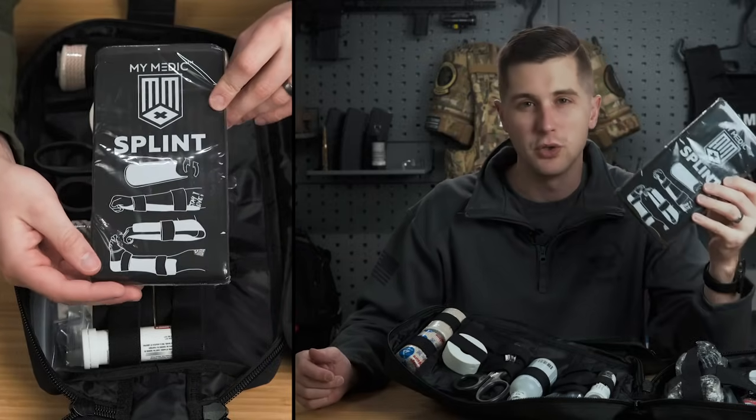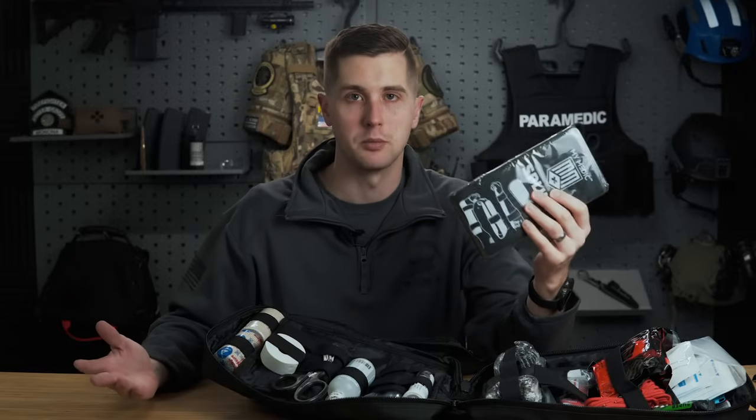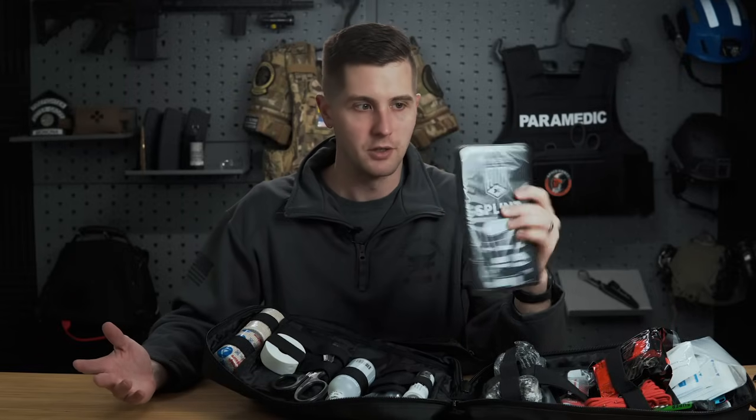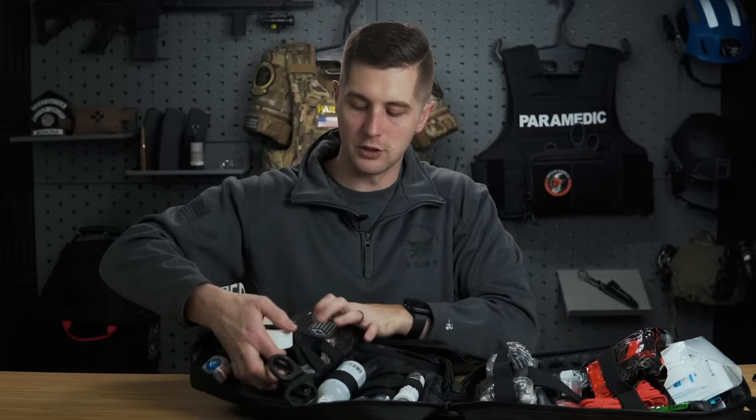This is kind of my go-to when it comes to pre-hospital splinting. On the ambulance, we've got vacuum splints, which are great, but they're not portable. This is the best portable splint on the market, if you ask me. And that just sits right in here for use.